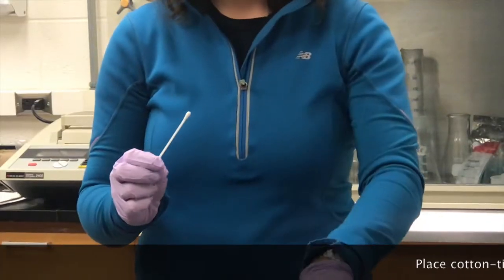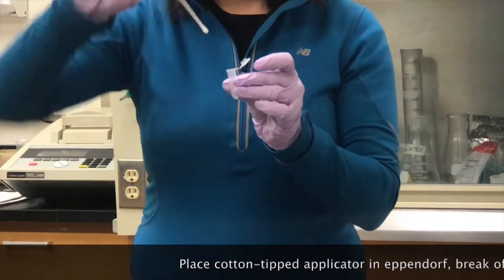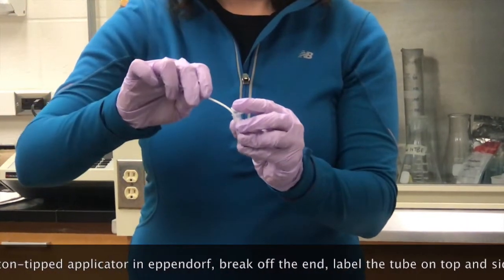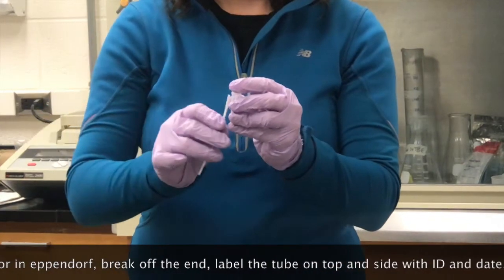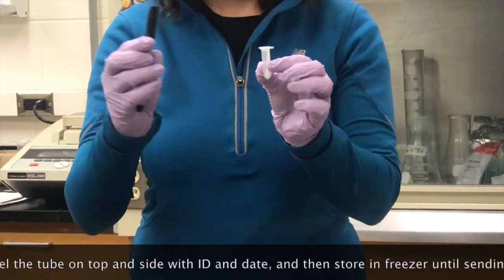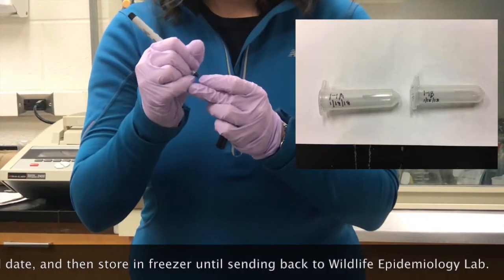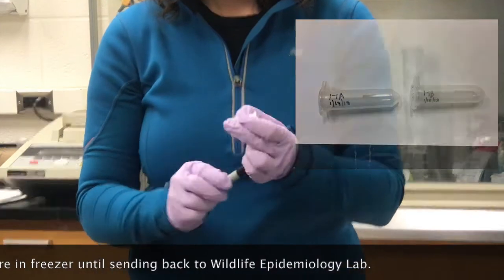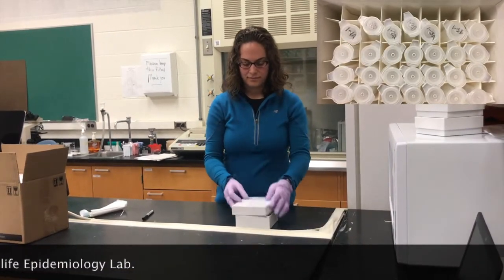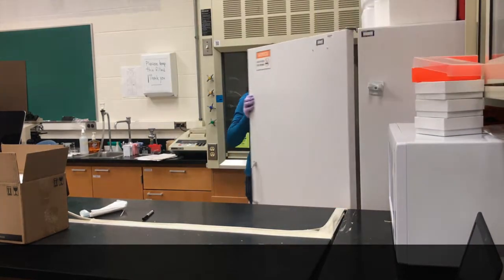Each swab should be placed in a clean, separate Eppendorf tube. Do not allow the swab to contact any other surfaces, animals, or swabs before storage. Place the swab in the tube and break off the excess swab handle before securely closing the lid of the tube. Label the tube with the date of collection, installation code, snake number, and swab letter. An individual lesion should have the same letter on the datasheet, the label in the photo, and on the tube. Store the tubes in the provided cardboard box in the freezer.